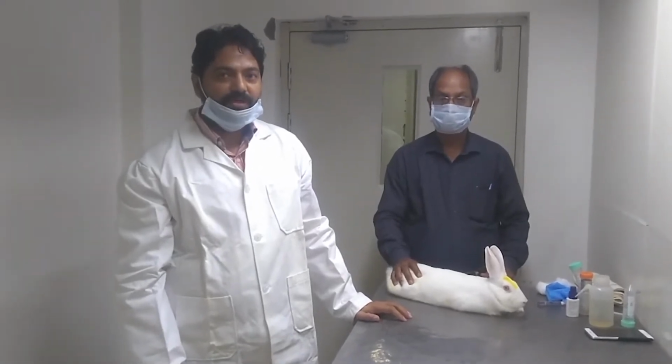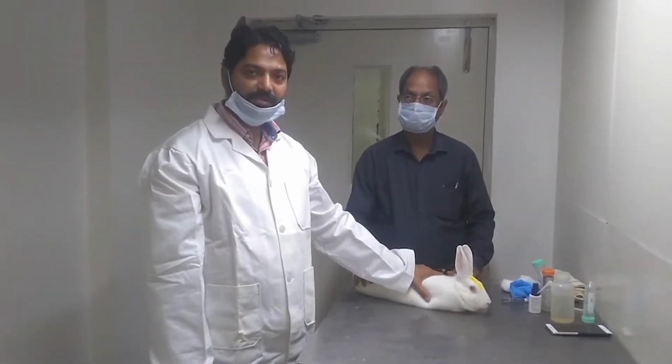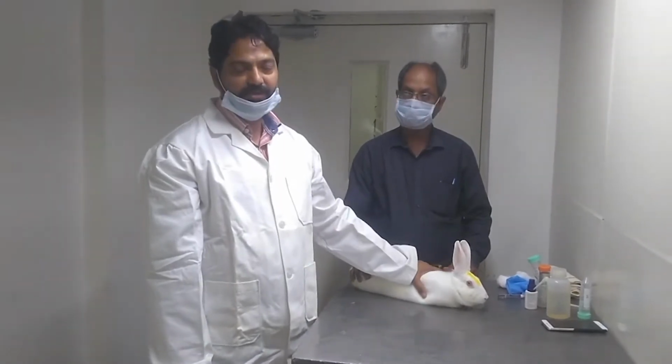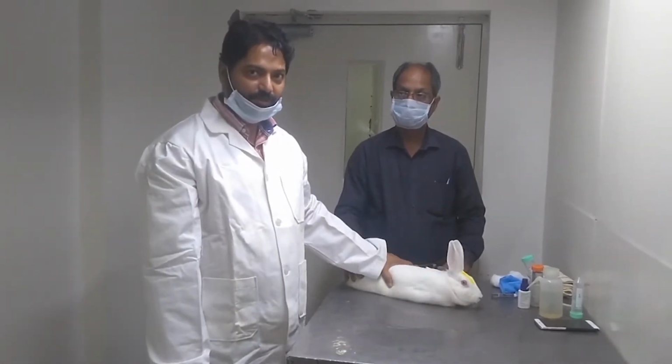We have come to the animal house. This is our rabbit, which will be immunized, and before immunization, we have to take a pre-immune bleed, so that we can compare later the serum and the anti-serum. So we'll now start how we immunize it.